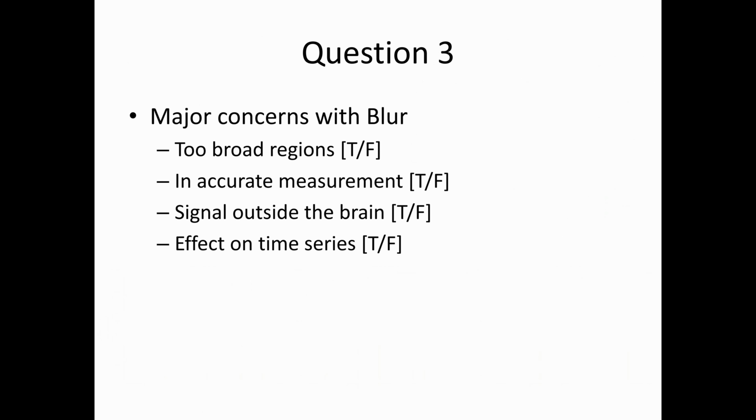And because behind all these blurs, basically the resting state activity is what's creating these correlations, right? So the more resting state activity somebody has, the more these effects become important. So there can actually even be a trait effect where one of your groups has more resting state activity than the other group, then you could potentially have a systematic error in one group that's different from another group. So it's something to be aware of.